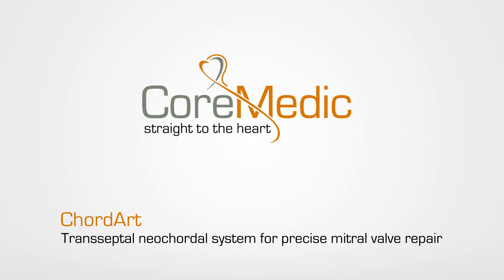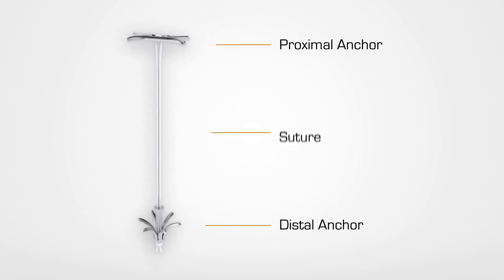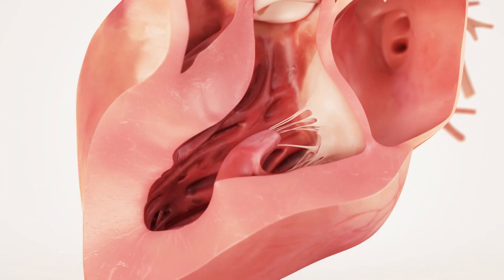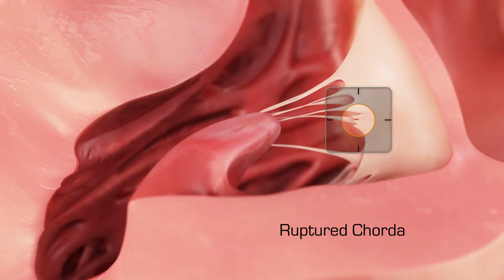Cordart: transseptal neocordal system for precise mitral valve repair. The Cordart implant consists of a distal and proximal anchor which are connected by a suture. It is designed to enable the minimally invasive replacement of ruptured or elongated chordae causing mitral valve regurgitation.